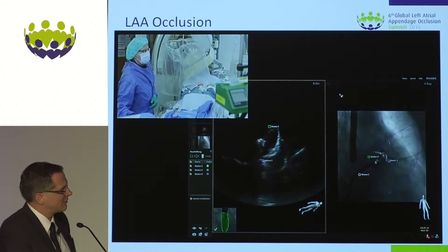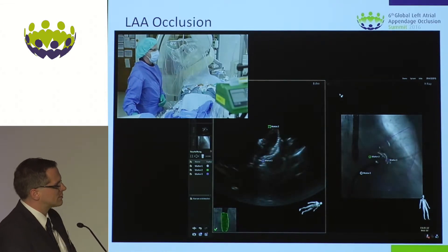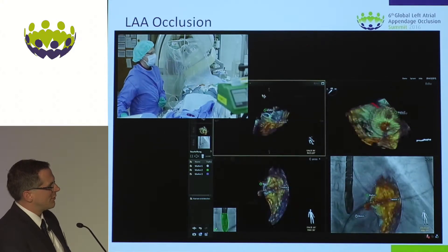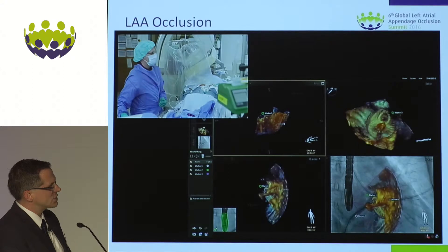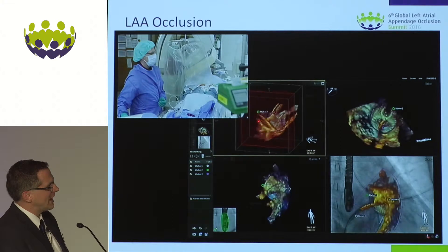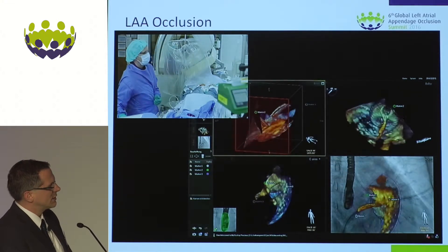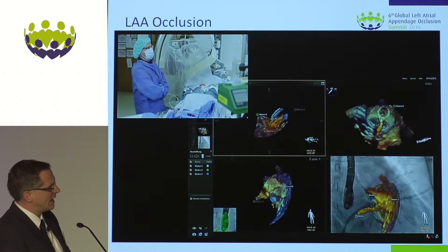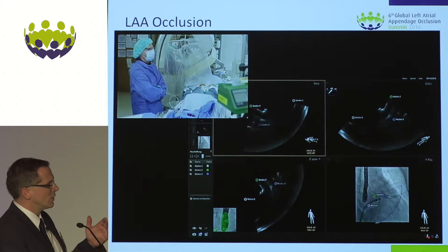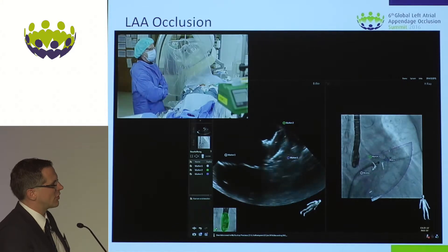Because I have both imaging modalities — echo and fluoro — I use both. I gave contrast and now switch to the full-screen echo navigation view, where I have live echo and a 3D free echo view where I can crop in and out of the left atrial appendage and look at my device from different angles, which even the echo operator is not able to provide, because I'm able to turn and crop in and out.